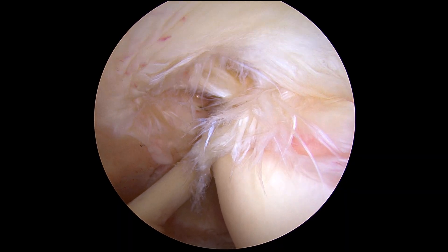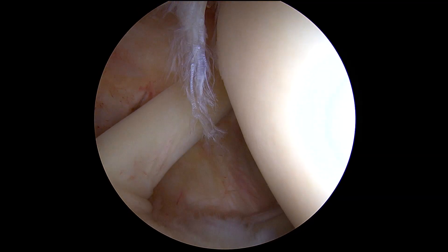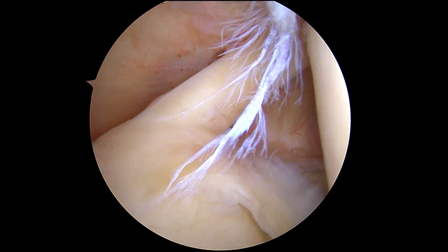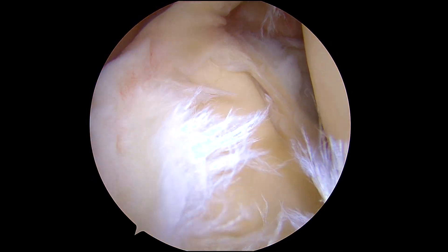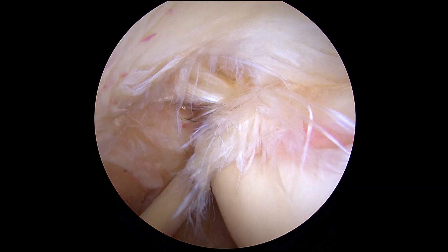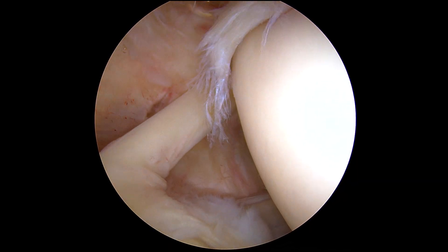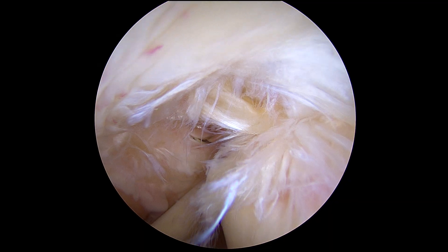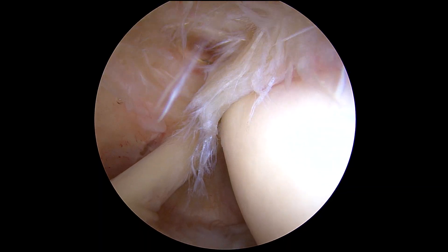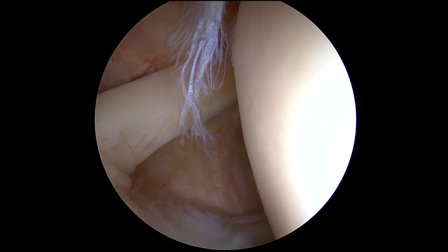A couple of things we're going to do: we're going to make our portal here through the rotator interval, which is this triangle in the front. We're going to release the biceps and perform a biceps tenodesis, then clean up the labrum superiorly and posteriorly, and debride the rotator cuff to get a better look to see if there is any full-thickness tearing. After we've done all the work in the joint, we're going to move the arthroscope to the bursal side and look down on the rotator cuff from that side and do any work we have to do there. So that's a diagnostic arthroscopy of the shoulder joint — we're going to get to work.